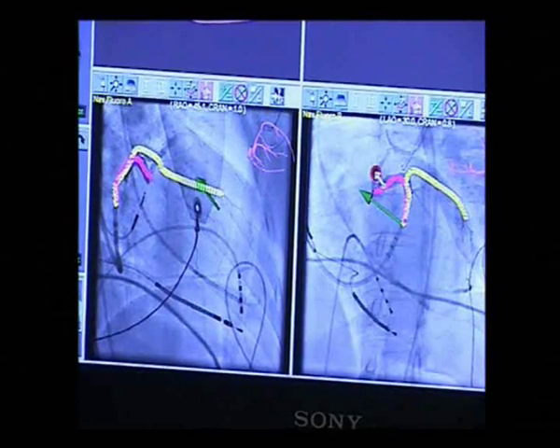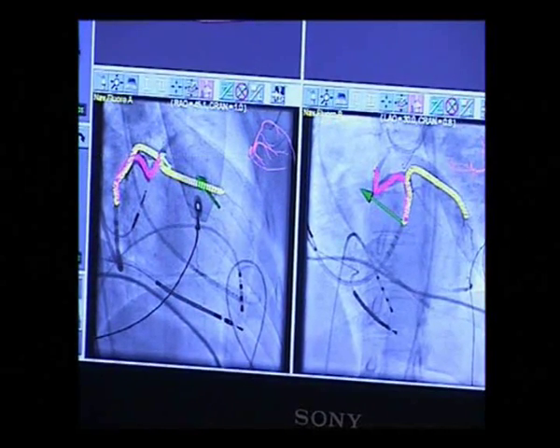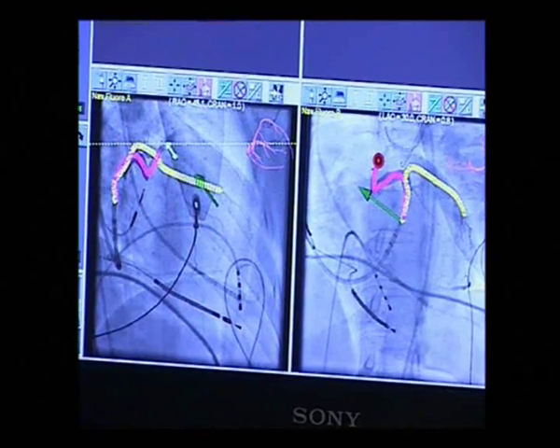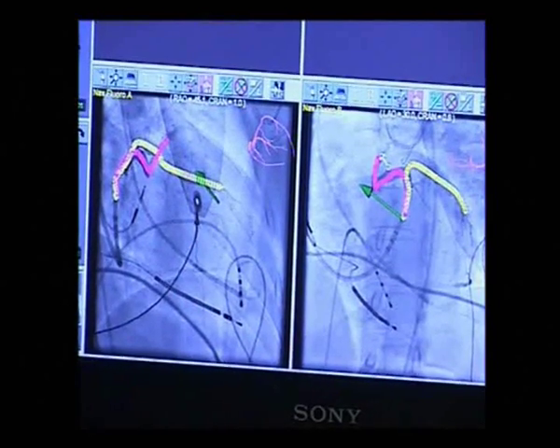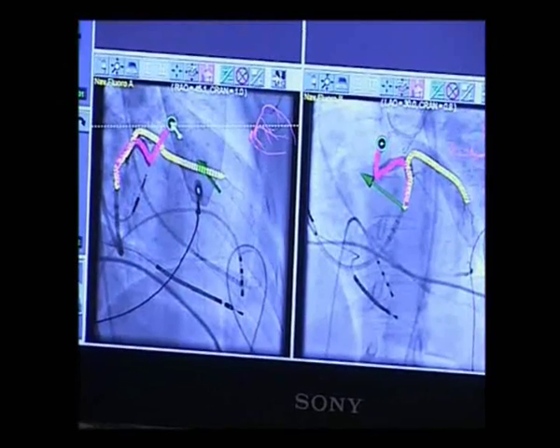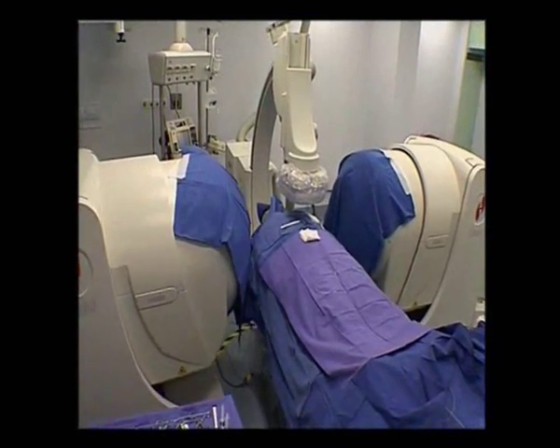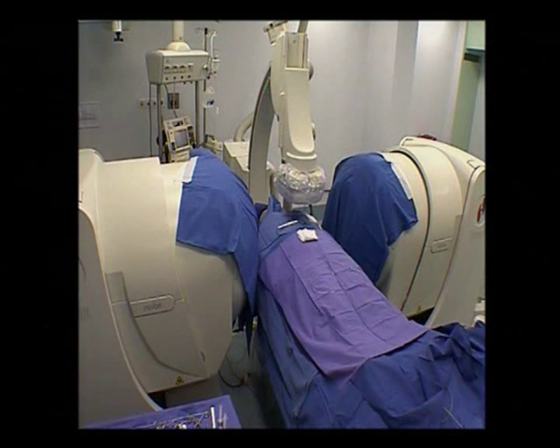In the two panels you can see how the roadmap reconstruction of the veins is performed. The left panel shows the right anterior oblique view, whereas the right panel shows the left anterior oblique view. The left lateral vein is depicted in yellow and the anterior vein being reconstructed is pink. The system employs two large magnets external to the body, set on each side of the patient, creating a spherical magnetic field around the heart.